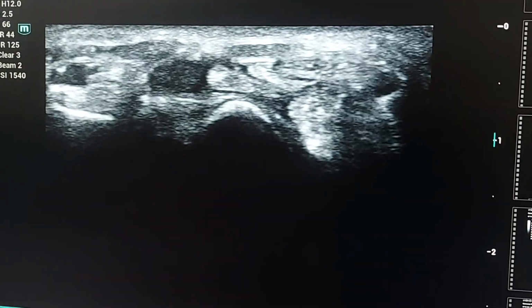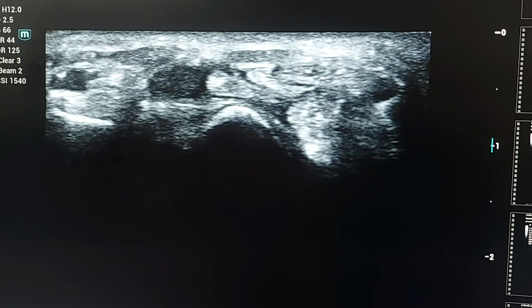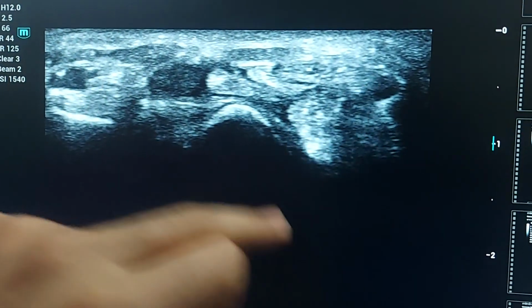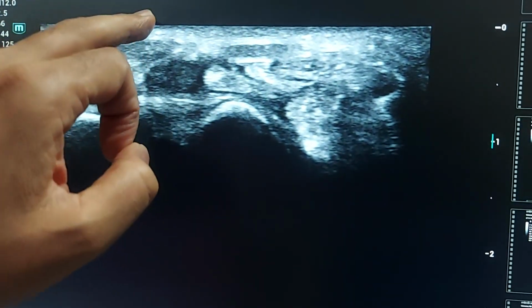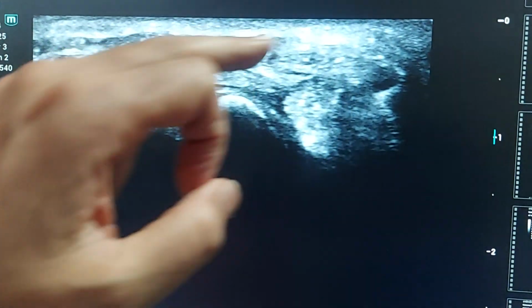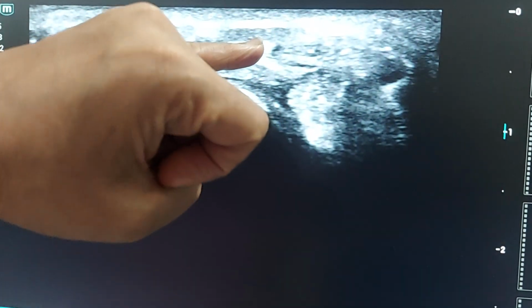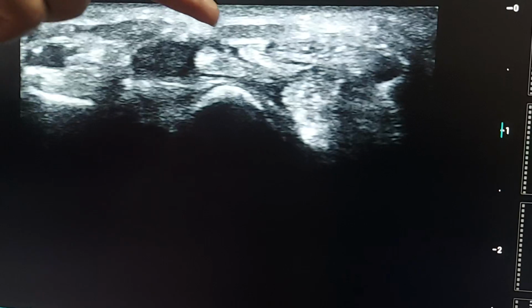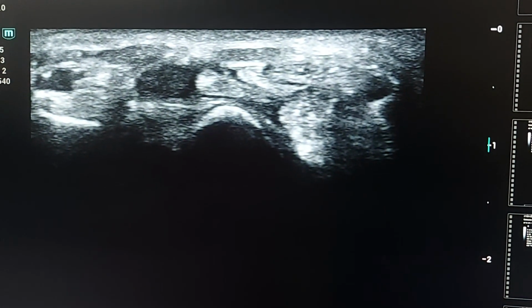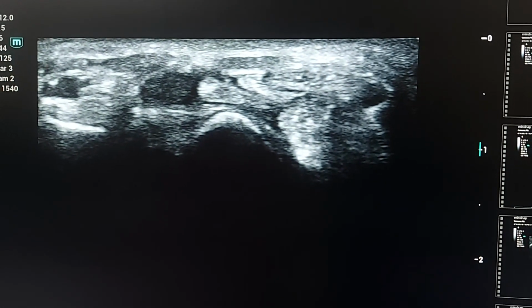Freeze. So whenever the nerve is impinged, you have to go from medial to lateral side or lateral to medial side. Just take care that you don't hit the arteries. Whichever side the artery doesn't come into your picture, you can inject from that side. Go below the nerve and go above the nerve. This should be your direction, above the nerve and below the nerve. So this is how we do a hydrodissection for the carpal tunnel.